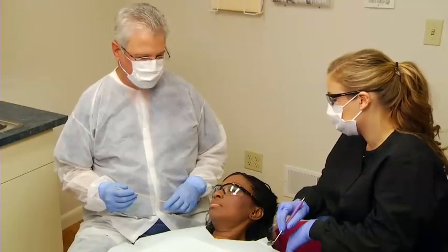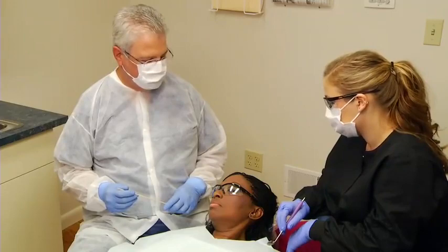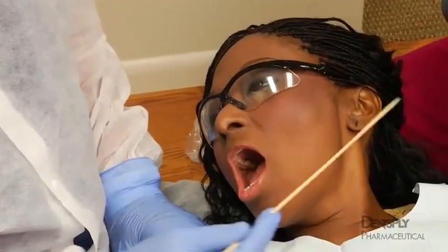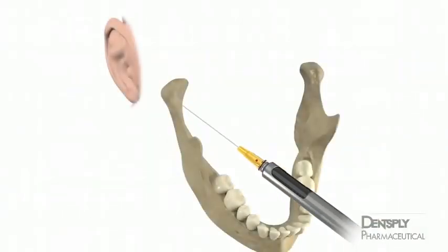The Gow-Gates technique relies on extraoral landmarks to establish the plane of insertion. With the mouth wide open, the angles of the mouth, the lower border of the tragus, and the neck of the condyle lie in the same plane. The needle is advanced in this plane just medial to the deep tendon of the temporalis muscle and through loose fatty connective tissue until it strikes the lateral neck of the condyle.